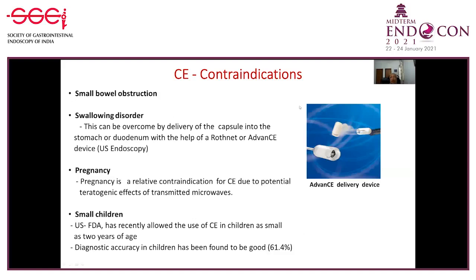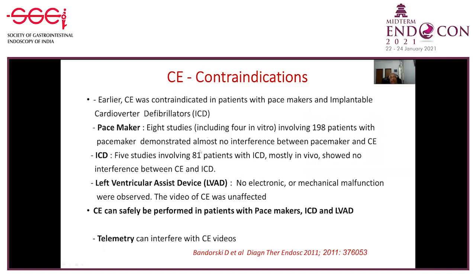What about pacemakers, implantable cardioverter defibrillators, left ventricular assist devices? In early days, this was a contraindication, but now there are robust studies which show that there is no electronic or mechanical malfunction with these implantable devices, and it does not affect the video of the capsule endoscopy. However, telemetry can interfere with capsule endoscopy videos.